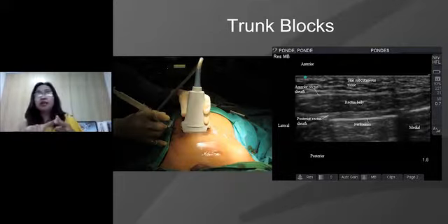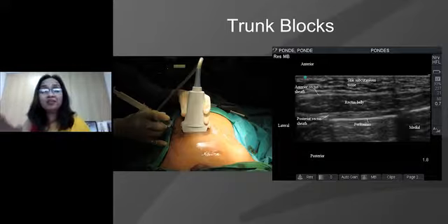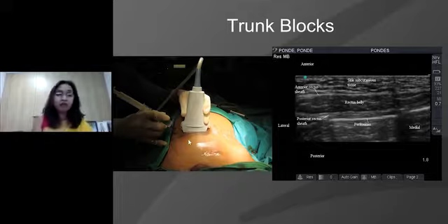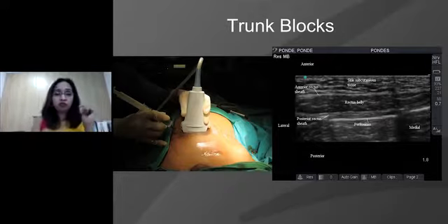Remember, as we said, abdominal wall blocks, whichever we are discussing right now, are going to give only somatic analgesia, and there is not going to be any visceral analgesia given by these blocks. So it essentially becomes a multimodal approach. We do continue with our NSAIDs, or tramadols, or whichever other post-operative pain management regime we are looking at. And this definitely takes a big chunk of pain away, which is the port insertion pain.